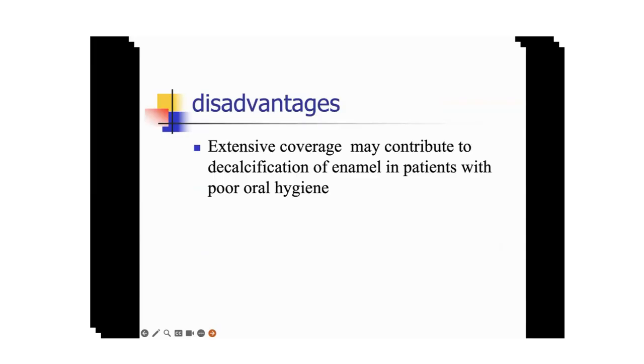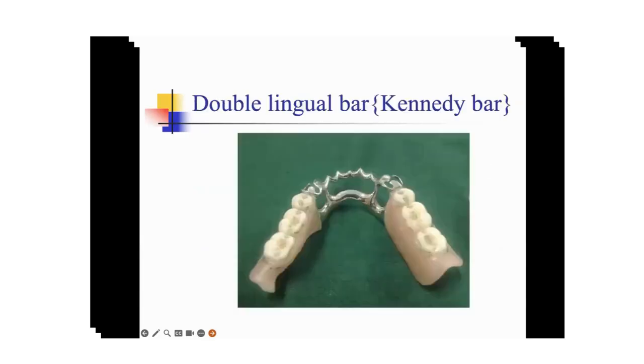It covers the tooth surface as well as the lingual soft tissue. So covering the tooth surface may contribute to decalcification of enamel in patients with poor oral hygiene.